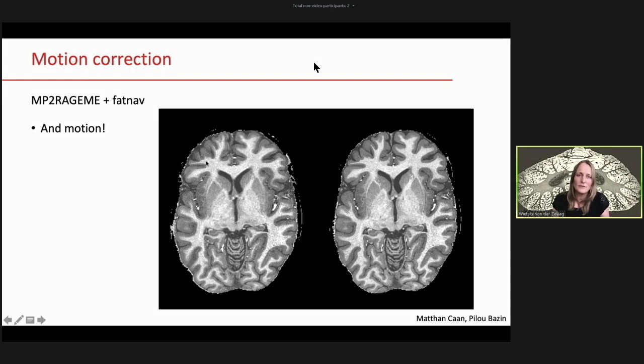So here on the left, we have a subject, which is a T1 weighted data set that looks pretty usual, not very alarming, until you look at the right, which is the corrected image. And then you see that there are large areas which are actually quite different. There's a fuzzy boundary here, which is really sharpened up. Most of the gray white matter boundary is actually sharper on the right than it is on the left, but also the vessels are especially noteworthy.